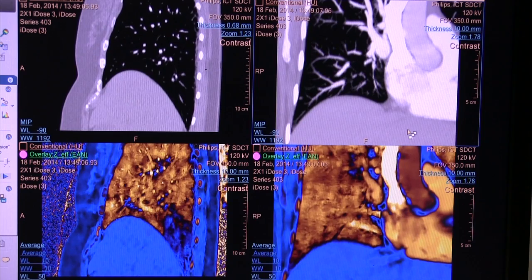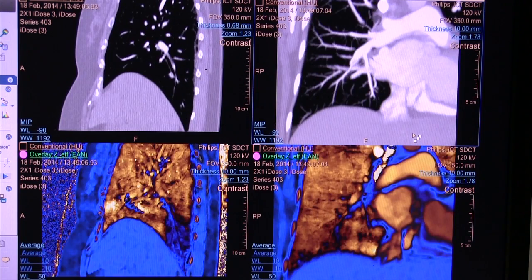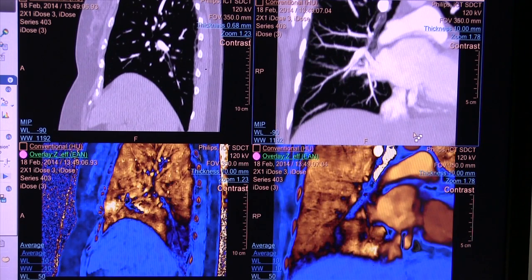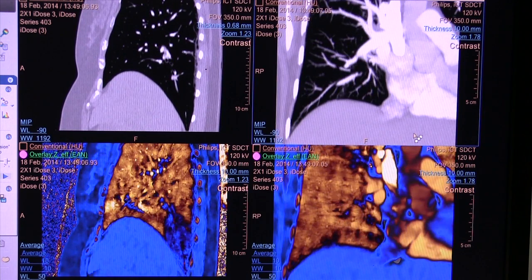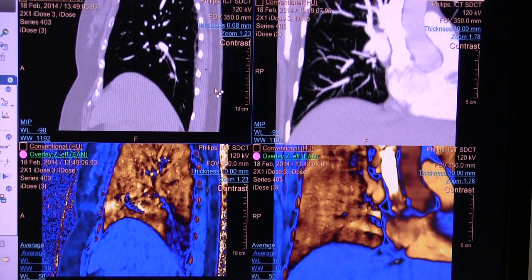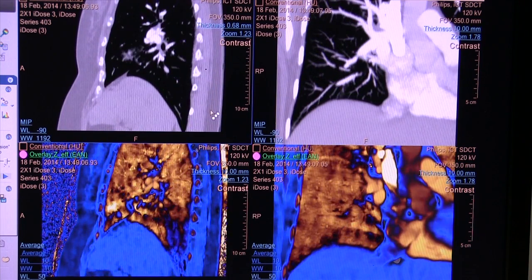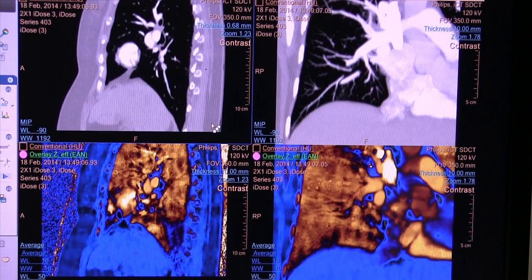This is an example of a pulmonary embolism with the multiplanar view on the top, with a density map on the bottom showing densities based on atomic numbers. The blue areas that are showing up on the bottom of the lung is part of a pulmonary embolism. This sort of technology can help enhance imaging that is sometimes difficult to do, or be able to reduce the number of scans you have to do with repeat protocols.